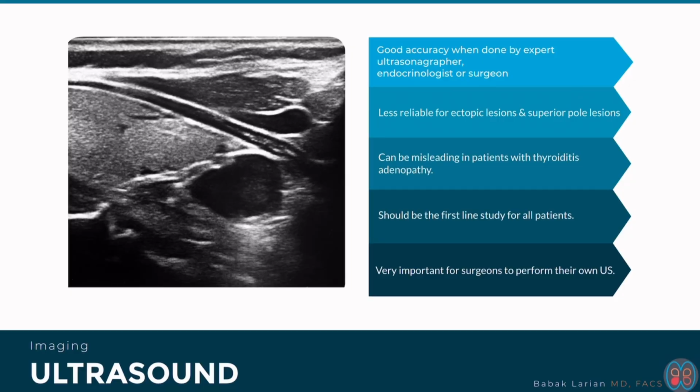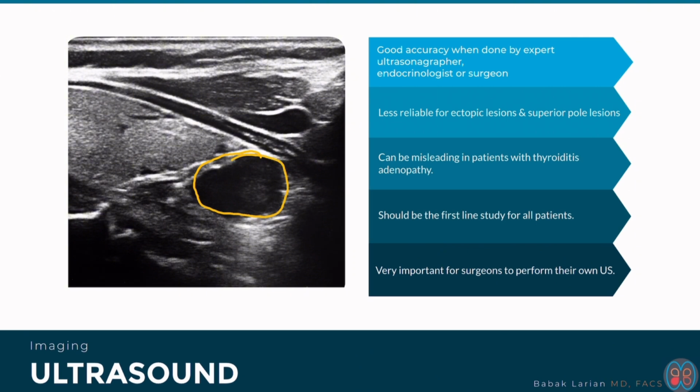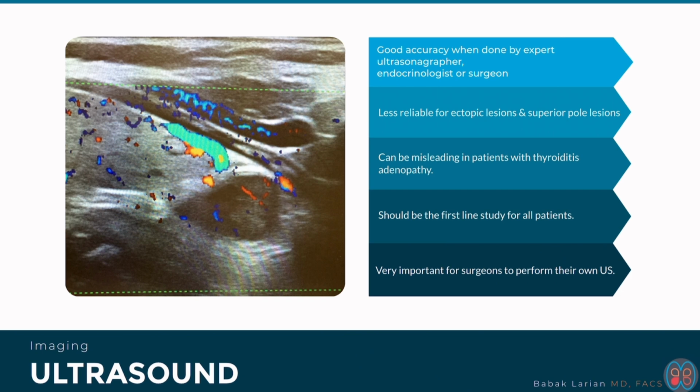So this is a cross-section in this orientation. Head is this way, feet this way. This is the thyroid gland. This is skin and fatty tissue under the skin. This is a thin layer of muscle. And this is the parathyroid with a distinctive dark look and a white shadow, right? This also shows blood vessels, showing a blood vessel that's coming in to feed the parathyroid. So it gives you very good anatomy, gives you blood flow and relationship to other structures.